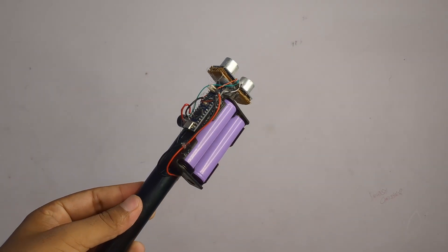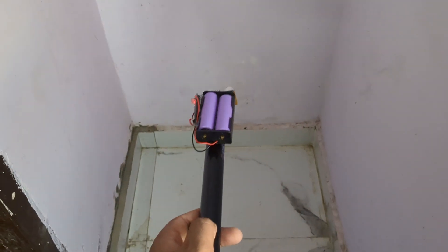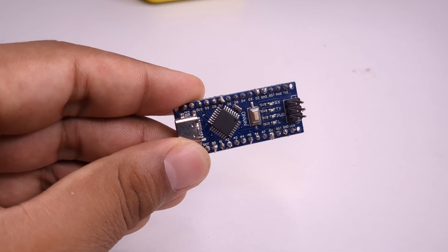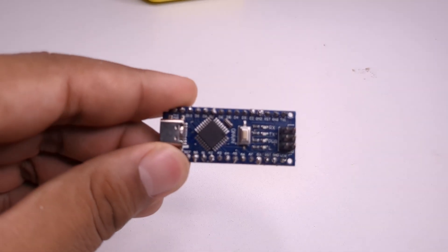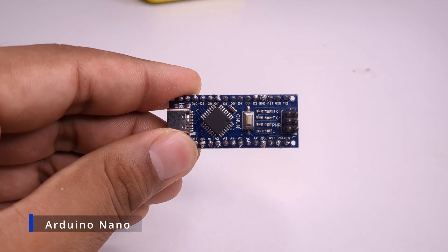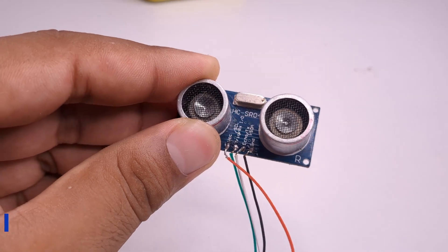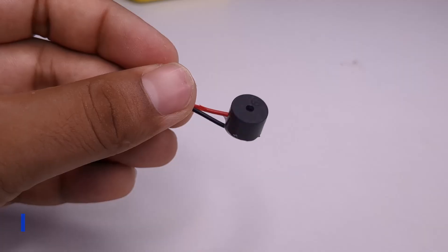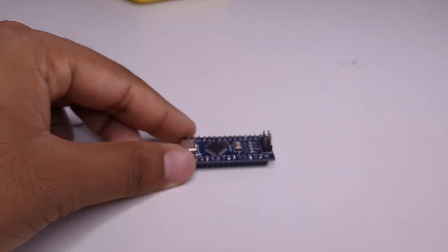This is not just a stick — it's a smart blind stick that detects obstacles and helps people walk safely. In this video, I'll show you exactly how I built it using Arduino. First, I took an Arduino Nano, an ultrasonic sensor, and a buzzer. These are the main parts — like the brain, the eyes, and the voice of this stick.